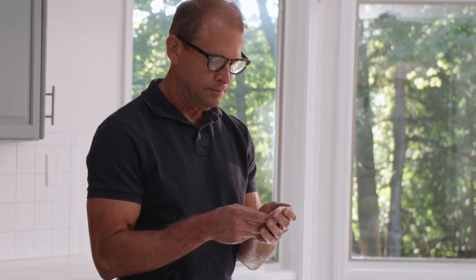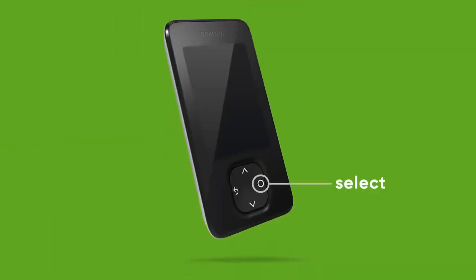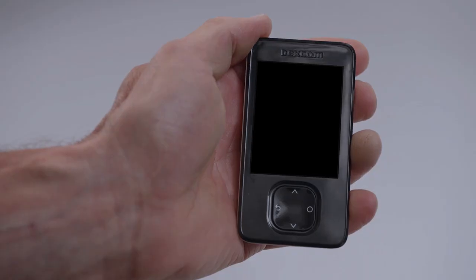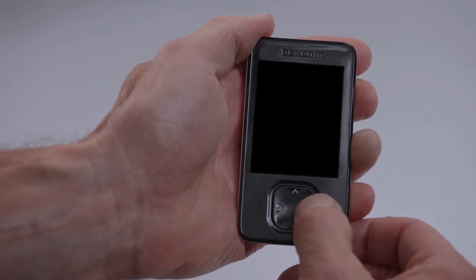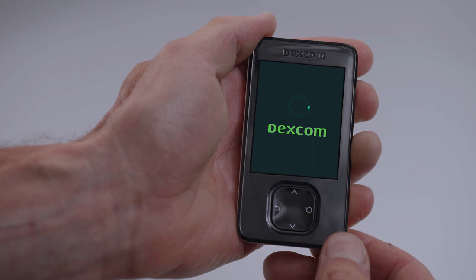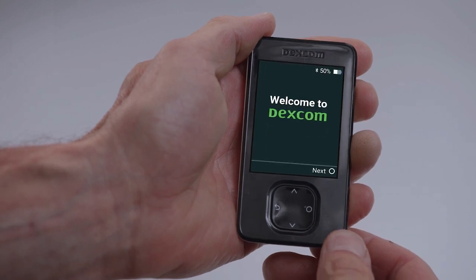Your receiver has four buttons: Select, scroll down, go back, and scroll up. To turn on your receiver, press and hold the select button for three seconds. The receiver walks you through the entire setup process step by step.